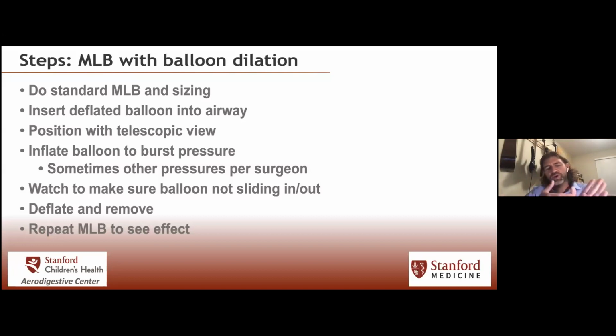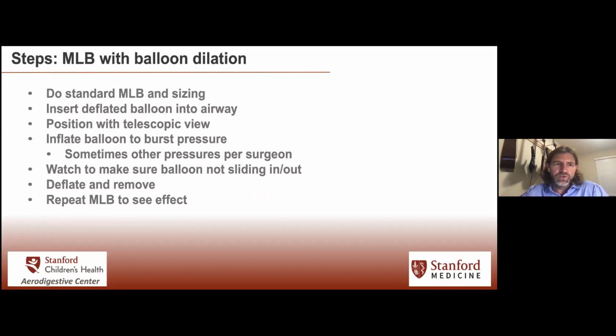There are also situations where when you put the balloon in the airway, you're also going to traverse the glottis. And with little infants, putting a balloon through the glottis can cause some edema that then can cause some postoperative sequelae, and you just have to be aware of that. Many times, though, that's the only place you can put it. So you have to take the good with the bad, as we do so many times in surgery.